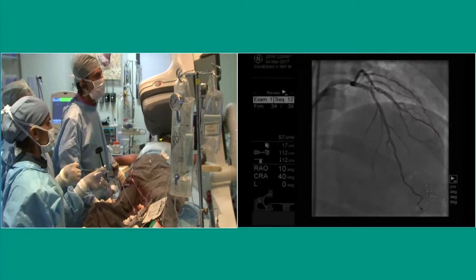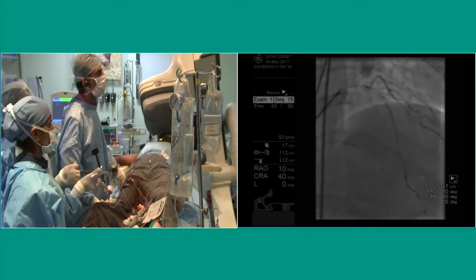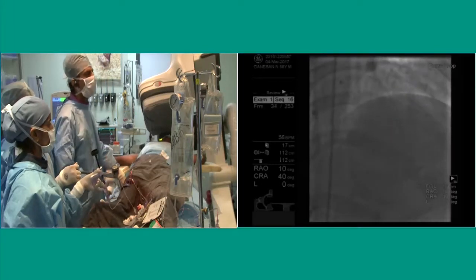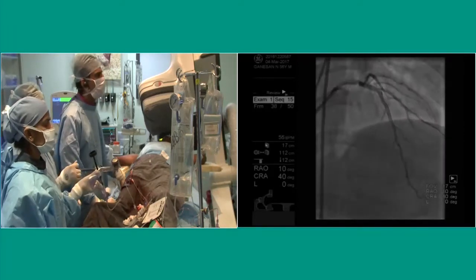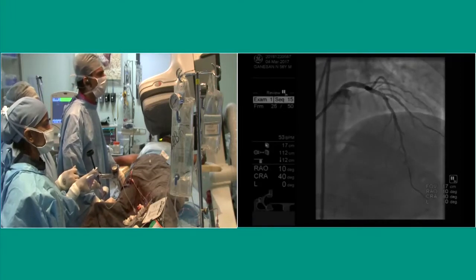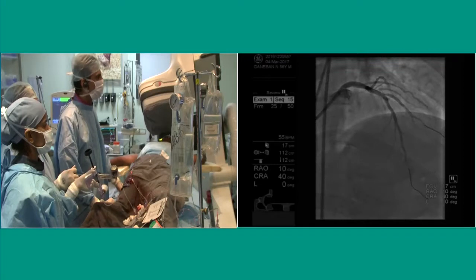This is before the POT. Next. And this is the POT. Keep moving. So we made sure we kept at the carina and also made sure we are just within the stent, and we went up to 20 atmospheres and then came back. We decided there was some small pinching in the diagonal, so we were thinking just to keep the struts open. Whether to put a stent or not is a question, but most likely I would not like to put a stent. I just want to do a kissing and then take the final picture and make the decision.